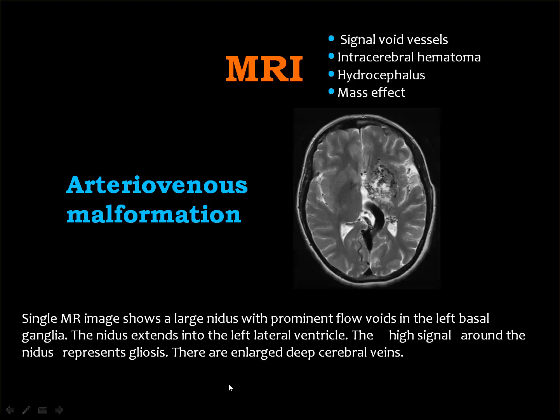Actually, on imaging at the time, we try our best to see the feeding vessel of the arteriovenous malformation and the draining vein. But actually, this is the role of angiography, and it is performed very well whenever you are going to treat this arteriovenous malformation by embolic material.